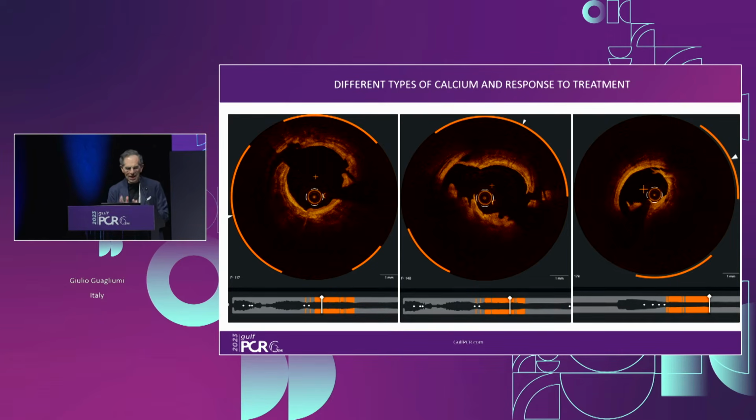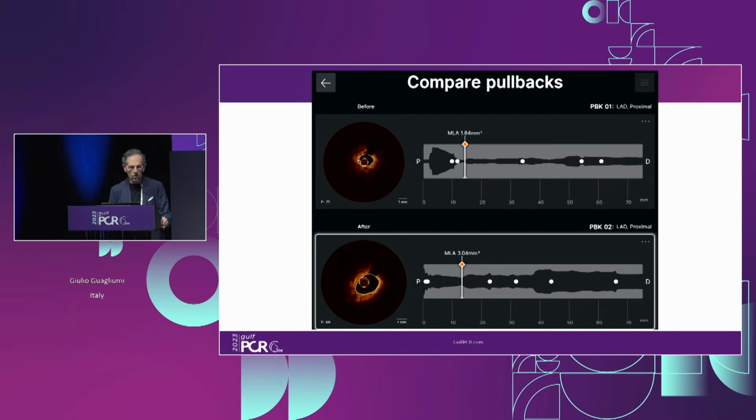That is another example I was possibly thinking about for this case. Here you can see an example of a deep crack, like we had today. This was not lithotripsy, this was not a cutting balloon, it was a simple non-compliant balloon. The message is we are still learning about how to combine the best device with the calcification morphology.